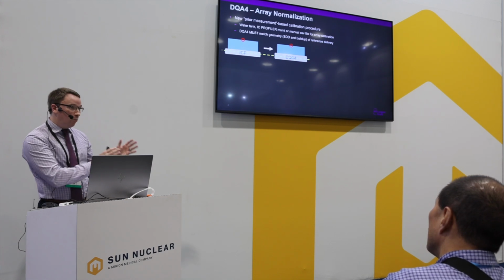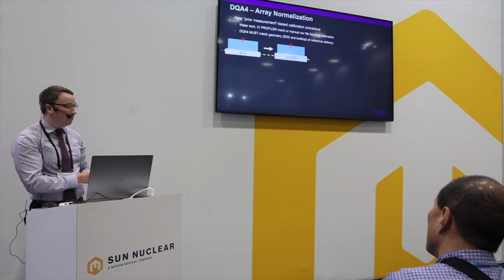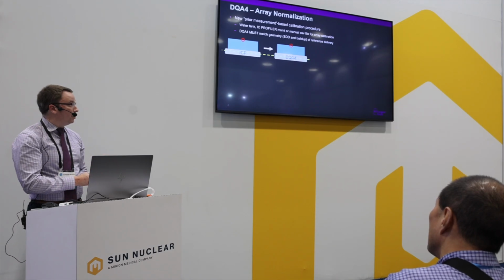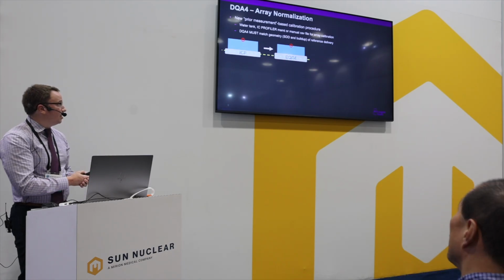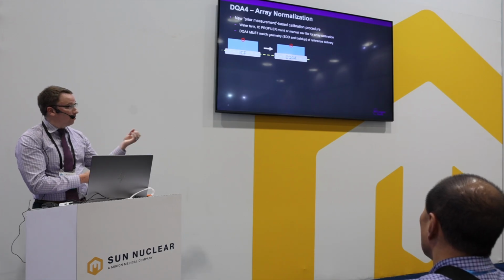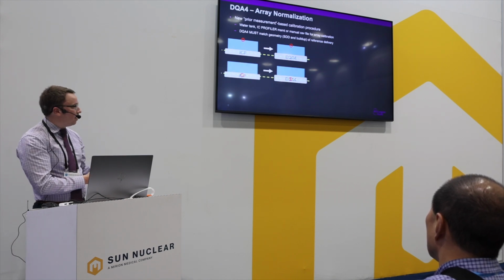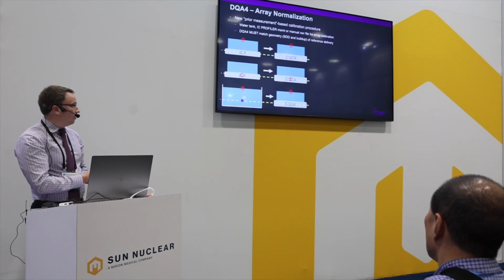So the idea is you take a water tank scan that defines your beam, or an IC profile, or even any manual CSV, and then you use that for a basis for your array calibration. The requirement then is that the daily QA4 must match the geometry that you took that profile in. So here's an example of an SSD calibration where I'm taking the IC profiler, measuring that, and just putting that file into the software and then irradiating, and that gives me the array normalization in just one single step. You can also do it isocentrically with buildup on top or without buildup on top, or you can use a water tank scan from any vendor with an ion chamber.